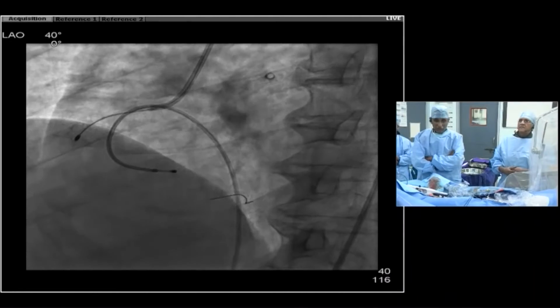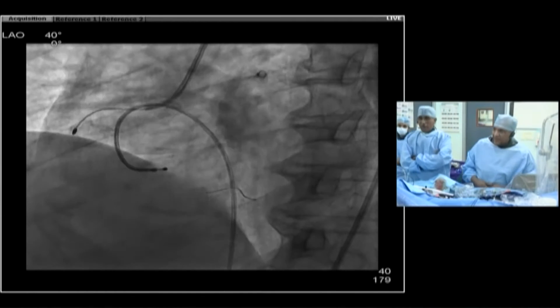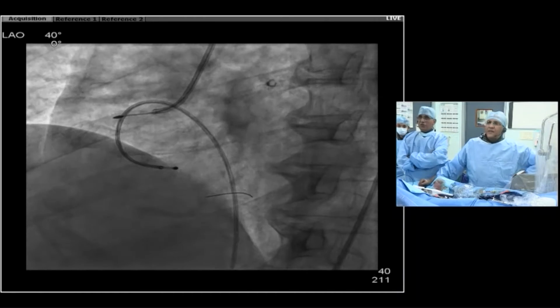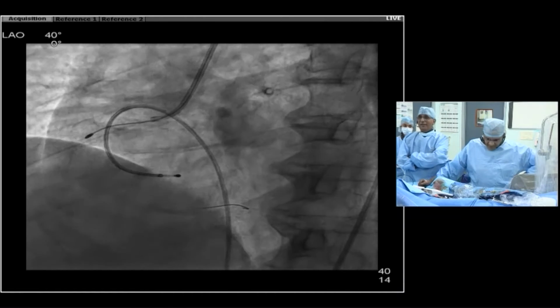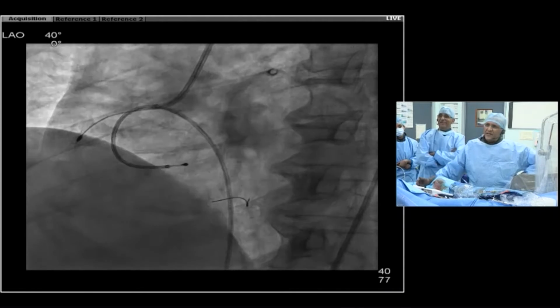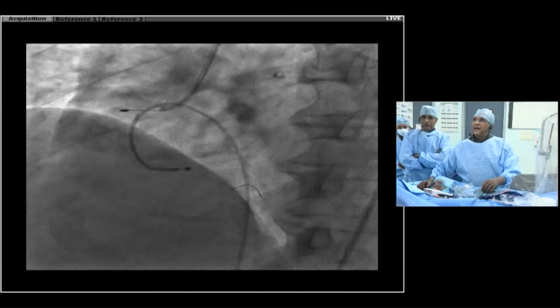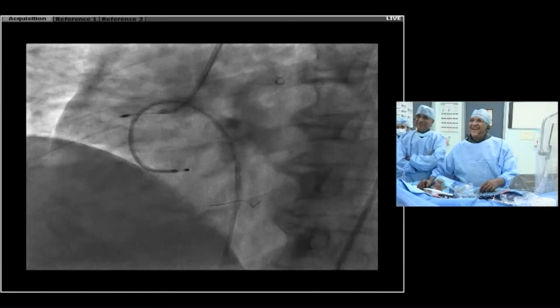Kirti, we are back with you. And that's a bigger burr. Perfect. Hello, are you able to hear us? Yeah. So that's a 1.5. Is it? Oh, so I'm just magged up. We're not magged up more than normal mag, for what I'm used to. I tend to work on that. Yeah, okay.